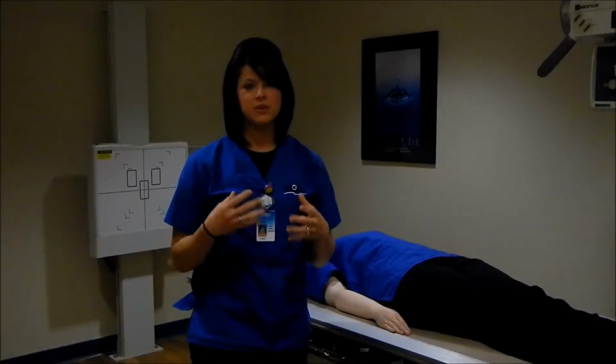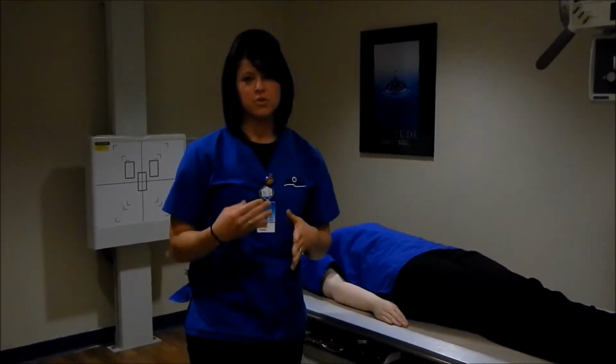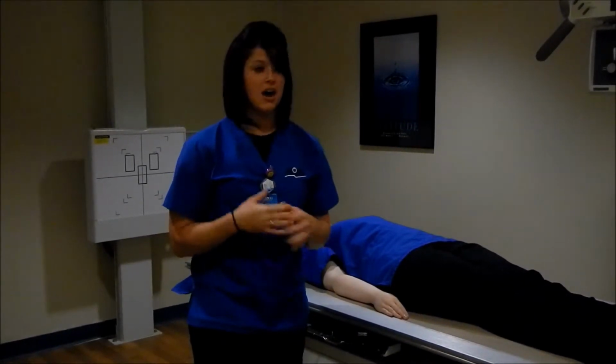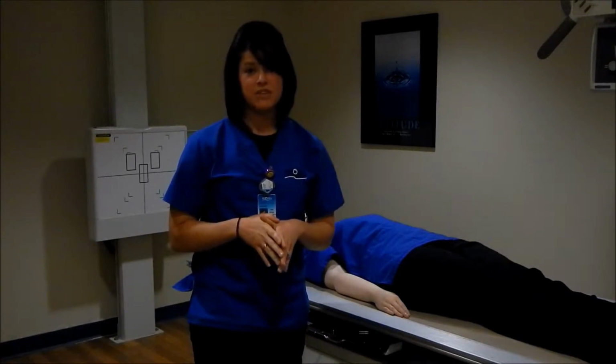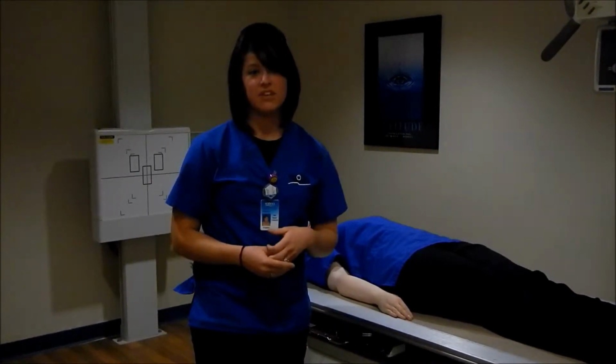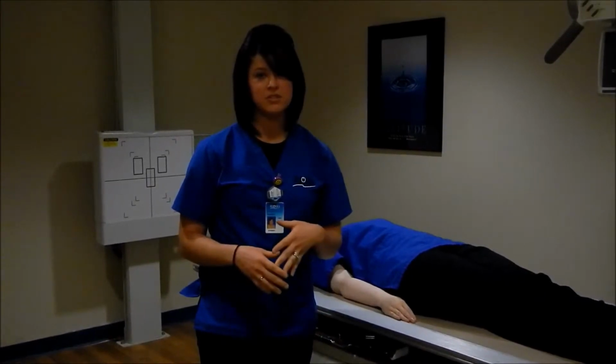Once I obtain the order for the x-rays, I need to check it and make sure it's accurate. Then I'm going to get the patient and go through their name and date of birth to make sure I have the correct patient. The next thing I need to do is get the patient ready for the exam, which includes having them change into a gown so that I don't have any artifacts on the images.